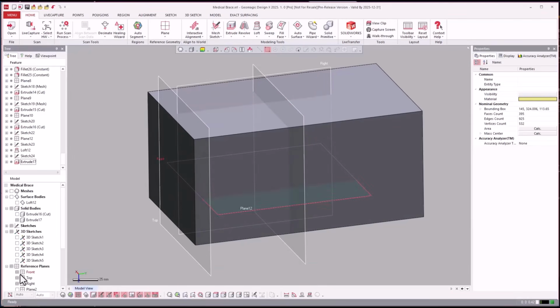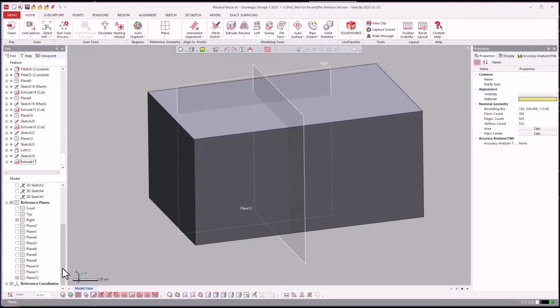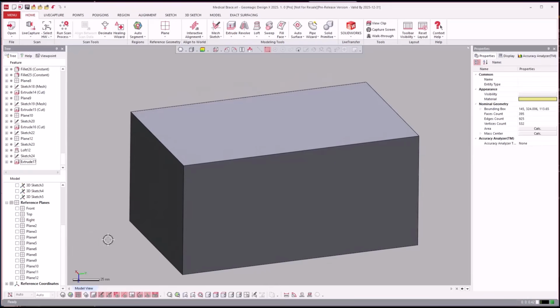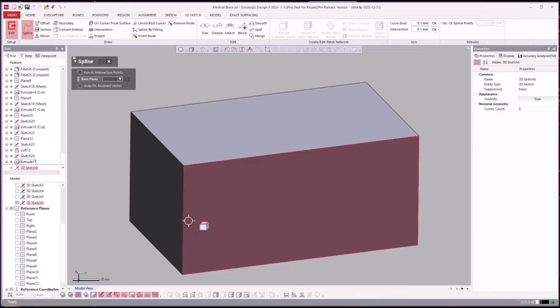This is a fillet question, very interesting fillet question that I discovered. I have to admit, I did not know that this tool was inside of DesignX. I'm embarrassed to admit this was interesting to me. So what you can do here is I'm going to do a 3D sketch, and I'm just going to draw an arc here.